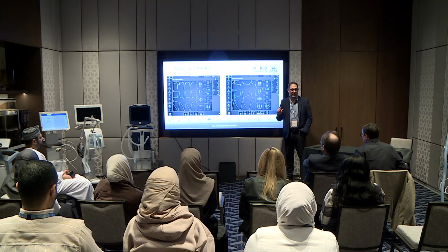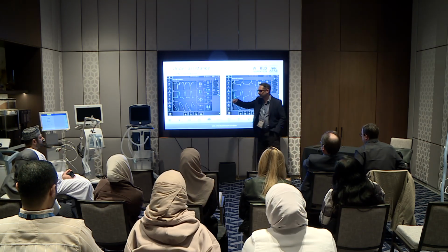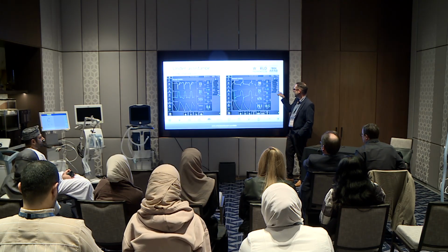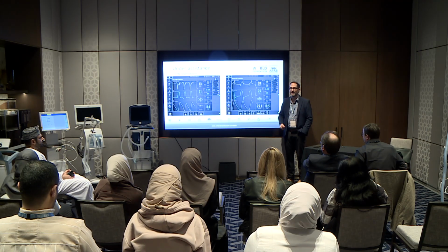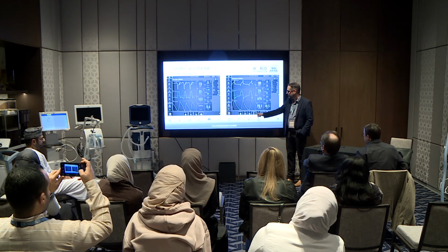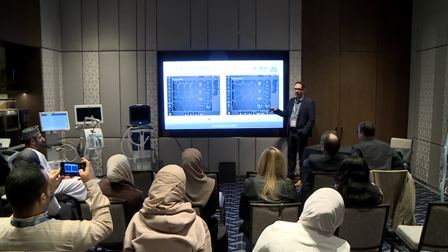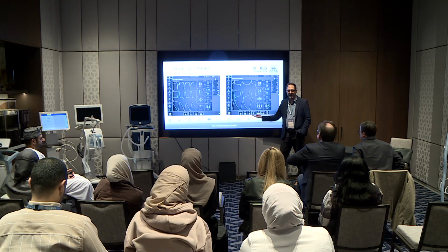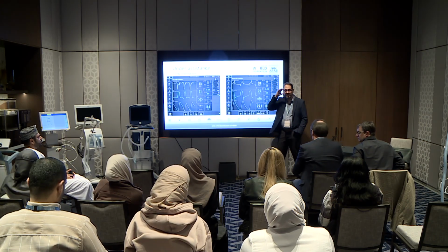We tried giving more because clearly the patient has a high drive. In fact, we just talked about P0.1, 9.6. After switching to pressure, 6.6, so that's a reduction, but it's still very high. When we increased pressure control, this was going over 12 mils per kilo of predicted body weight. This is a patient who had worsening ARDS. They're on a PEEP of 12 already and 60%.